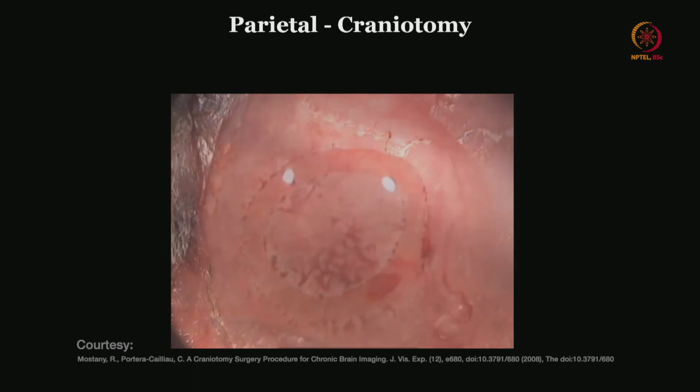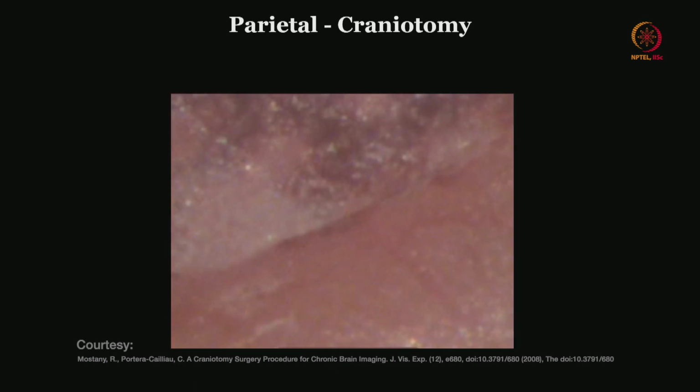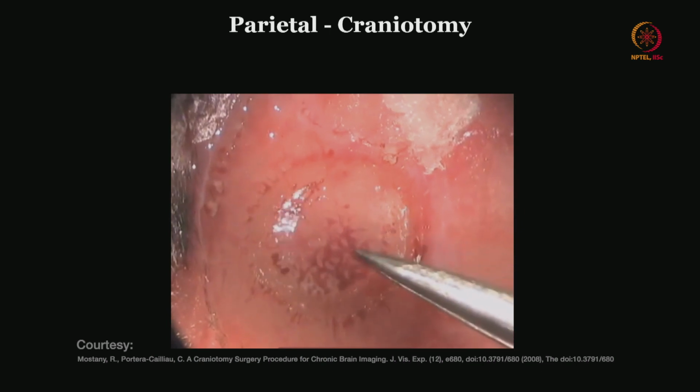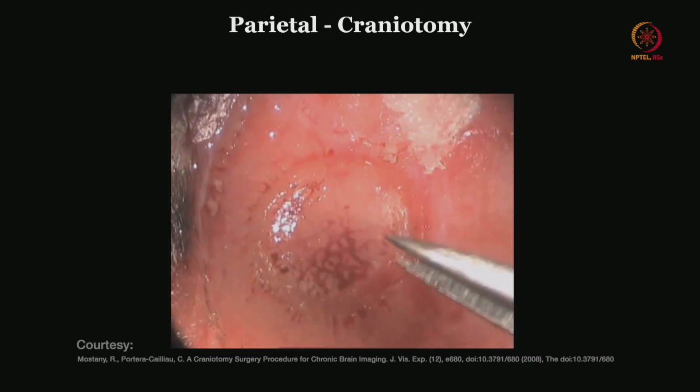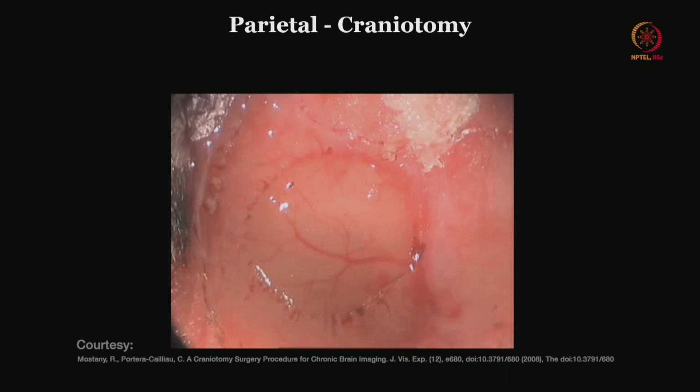And what has been placed here is the artificial CSF, and then you try to gently lift up. You can see the edge of the bone that is separated, and then with the Dumont microforceps you can lift up the skull. In a young mouse, the skull is going to be pretty thin. So because of that, you may be able to lift it up that way.